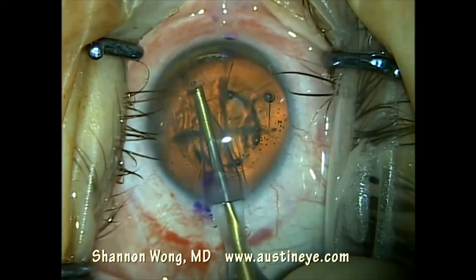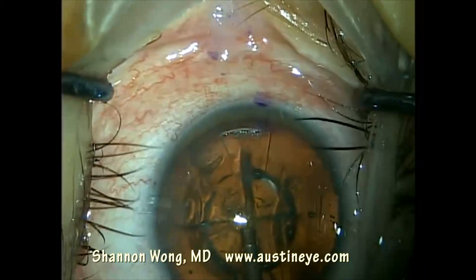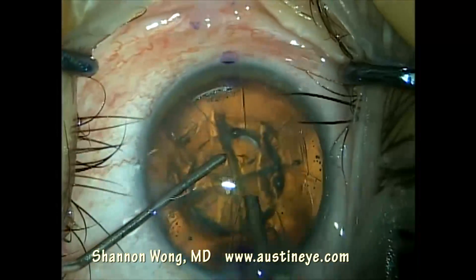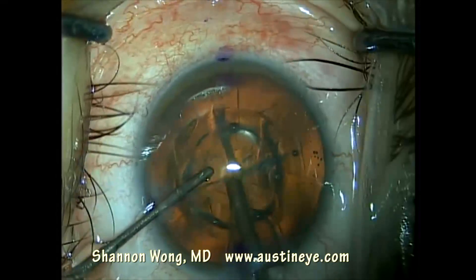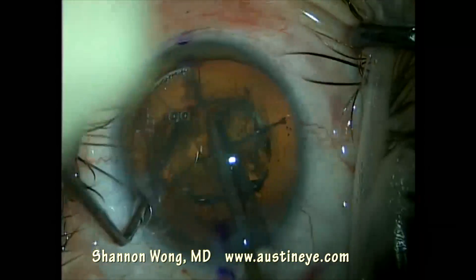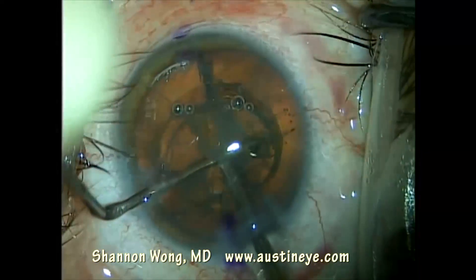I'll use less phacoemulsification energy in removing this cataract. My initial step is just to increase the width of the initial groove. I don't go very deep at all, because all I'm doing is widening the initial groove to place my instruments between it so we can separate the pre-softened nucleus. We just separate it and it separates nicely. We rotate the lens and separate the other pieces as well.